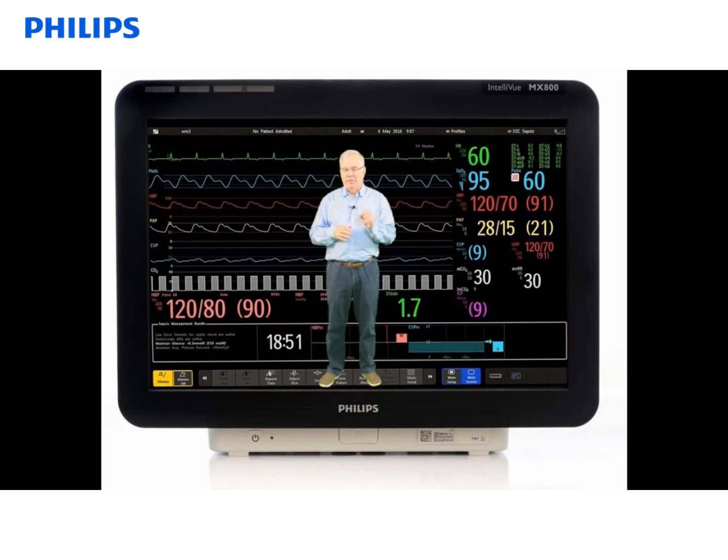Next to the power button is a little green LED, which indicates that the monitor is plugged in and there is power to the monitor. In the center is our quick release mount — push that in and you can remove the monitor from the bracket it's mounted to.